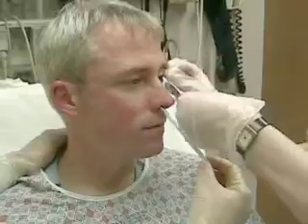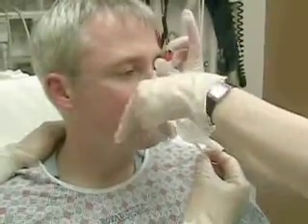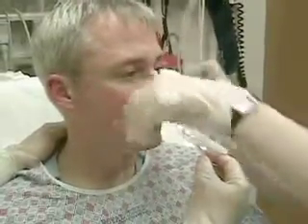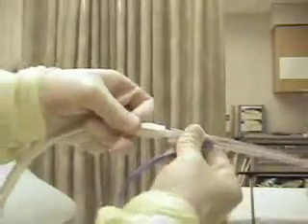The tube should be secured to the patient prior to transport to the radiology suite. Take a 5 to 7 centimeter strip of adhesive tape and tear it vertically for 1/2 of its length. The wide section is placed across the patient's nose, and the two tails are then wrapped in opposite directions around the NG tube. You may now connect the nasogastric tube to suction.